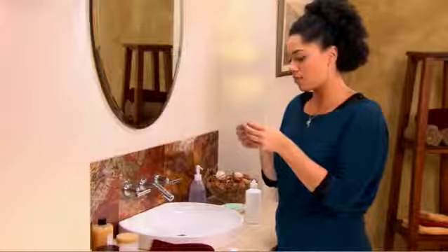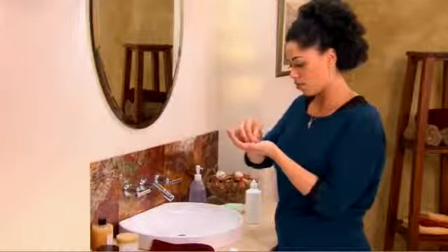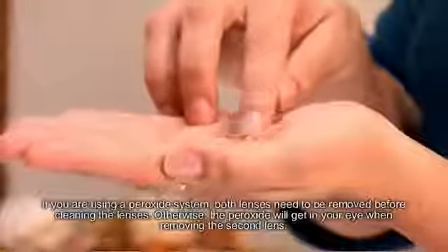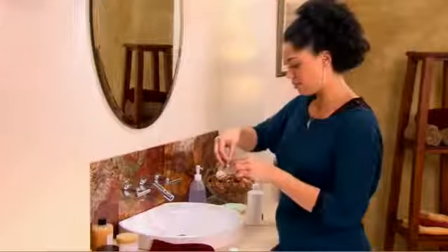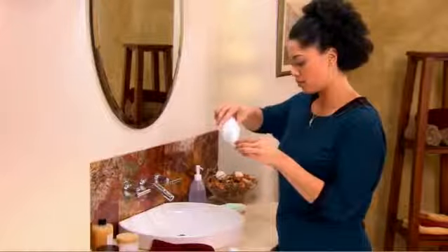After removing the lens, place it in the center of your palm. Pour contact lens solution onto the surface of the lens. Using your index finger, gently rub the solution back and forth into the surface of the contact lens for 30 seconds. Clean the other side of the lens as well. Now place the freshly cleaned lens into the lens case, cover with contact lens solution, and close the lens case.